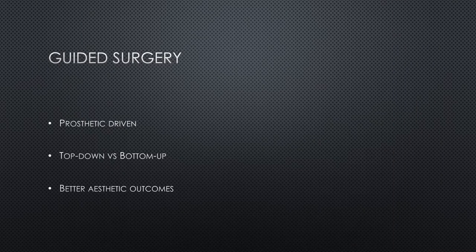And this is a guided solution, right? We use guided preps and some perio guides. Another one, of course, very huge, and you think of it immediately, is guided surgery. Again, prosthetically driven, top down versus bottom up, and you get much better aesthetic outcomes.